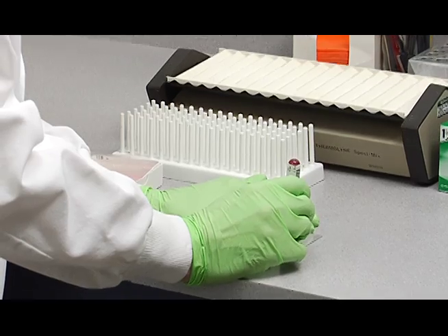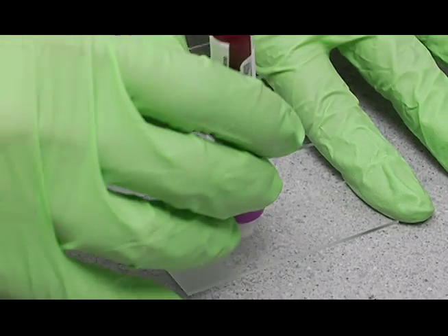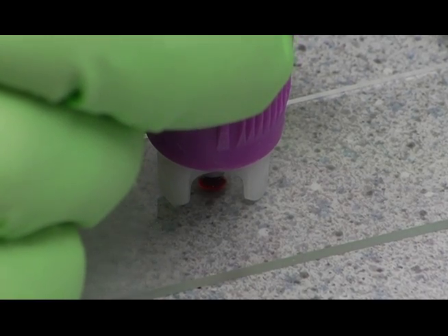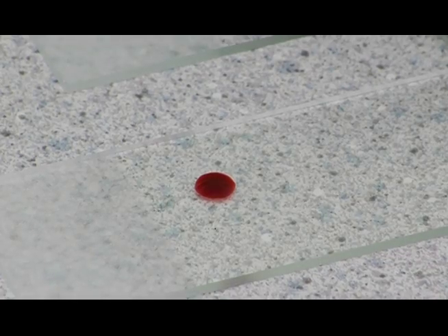Then place a drop of blood right there on your slide next to the frosted edge but not on it. You want it right in the center there. And that's a perfect-sized drop right there.